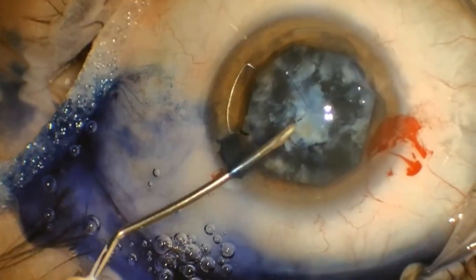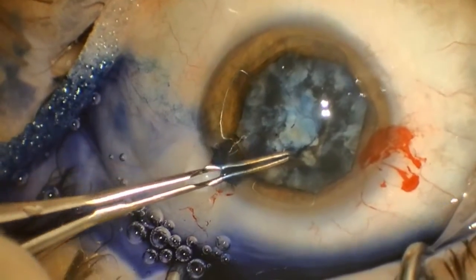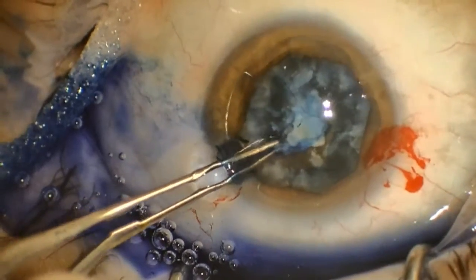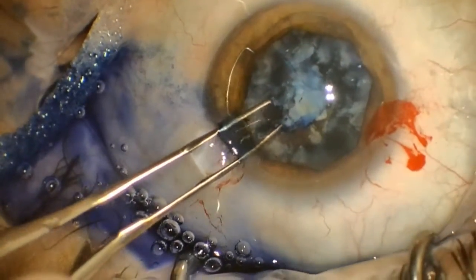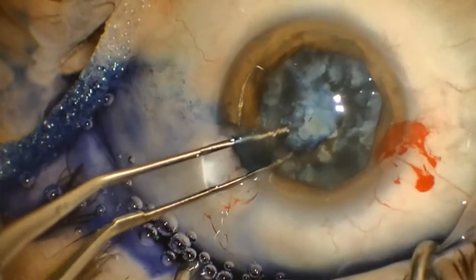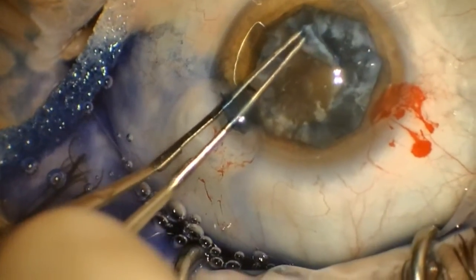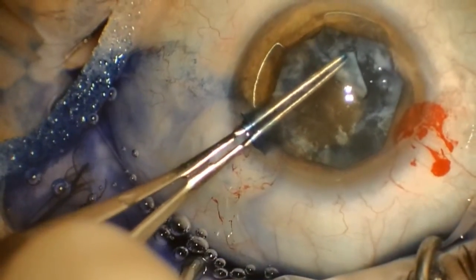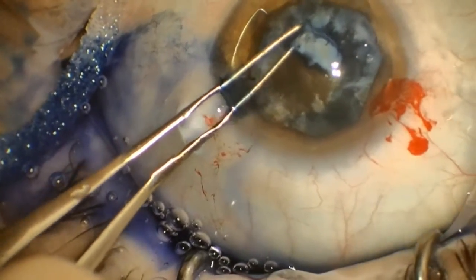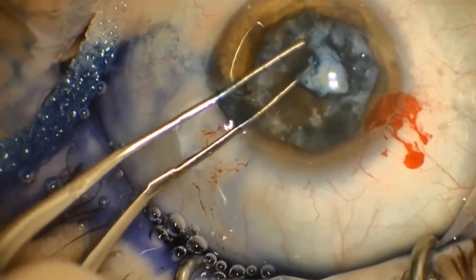The case proceeds without any further interference from the iris, which is retracted out of the way. You can see how manipulations of the instrumentation are easy because the iris ring is out of the way. The main incision is right over one of the feet and the elevated portions of the ring are not disturbed by the forceps or phacoemulsification instruments.